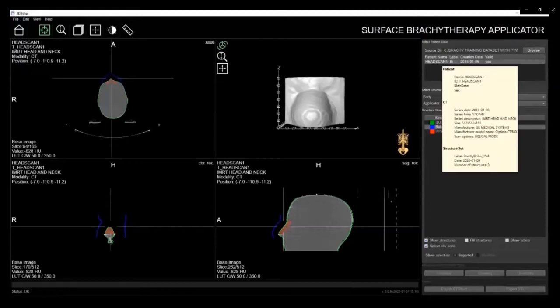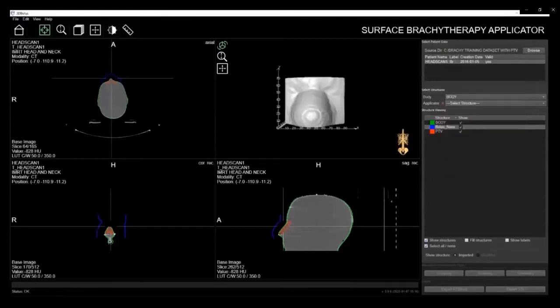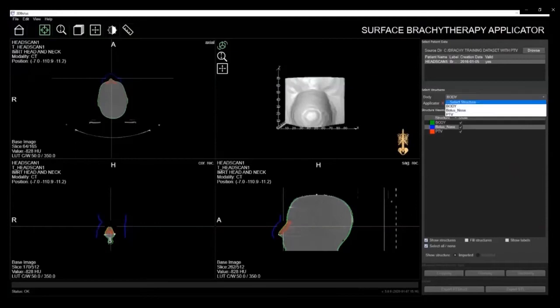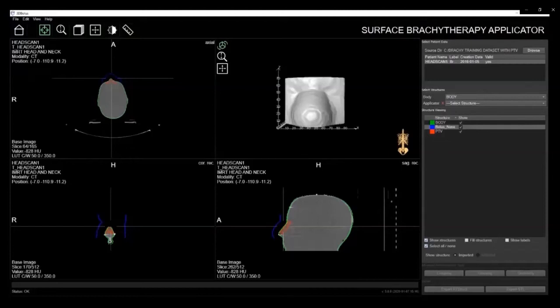The next step is to identify the applicator. From the drop-down menu in the Select Structures window, you can choose your body structure, which is taken from the TPS and based on the patient's CT scan, and then select the structure that is used to create the applicator, in this case, the nose.